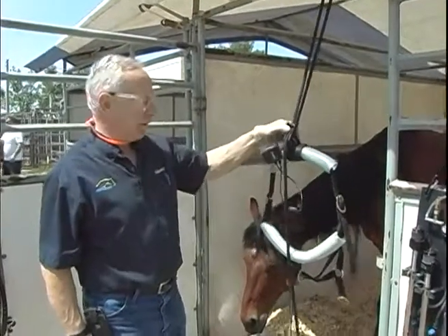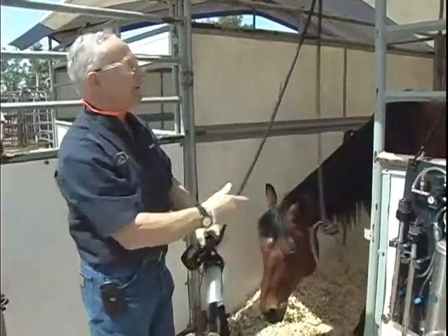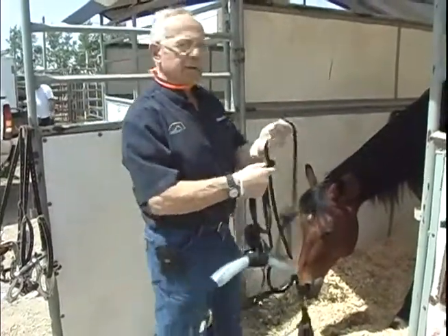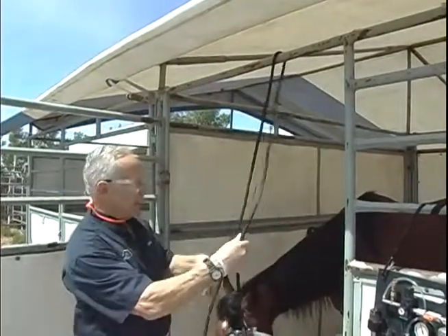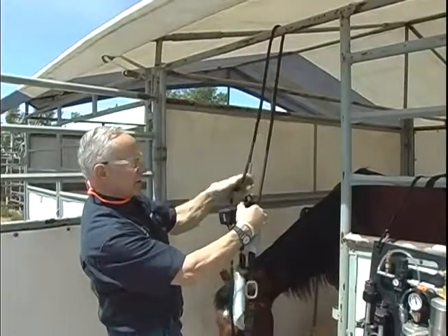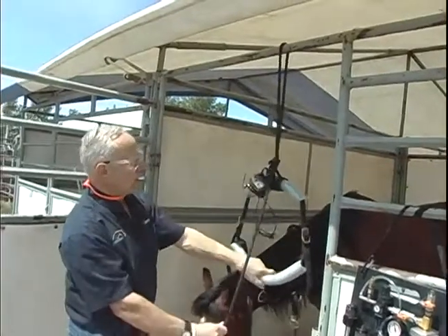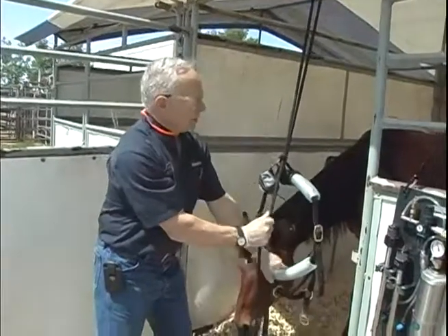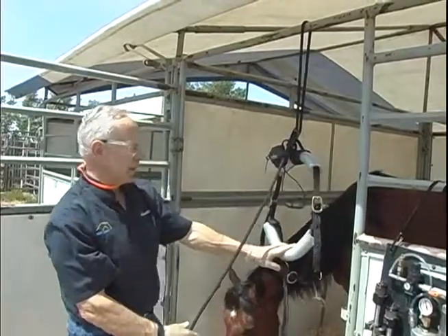This is the PowerFloat dental halter, used to support a horse's head so that a veterinarian can do dentals alone without any assistance. So to do this in a stall front, the rope is thrown over from the inside to the outside so that the rope does not cross. It's inserted into the cleat, and it can be lowered or raised by flipping the rope out of the cleat, and it can be lifted up by allowing the rope to get locked in the cleat.